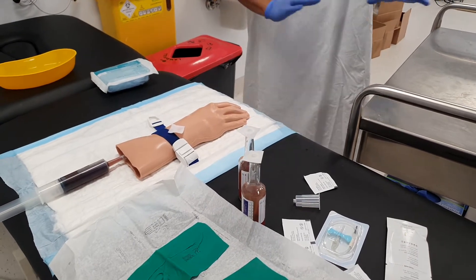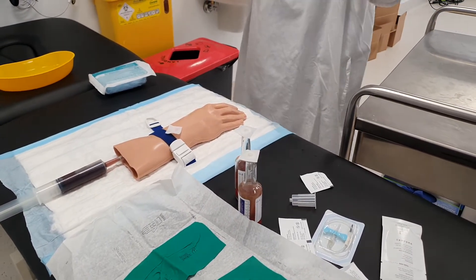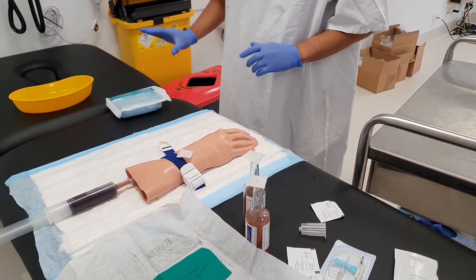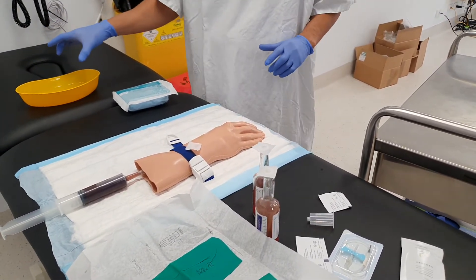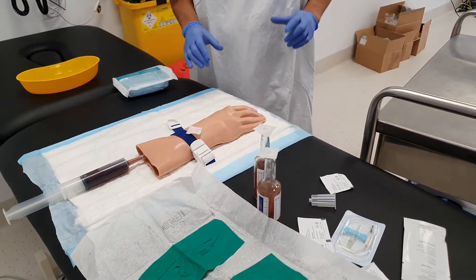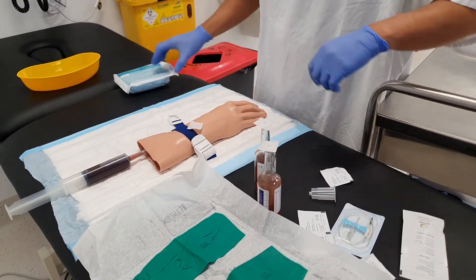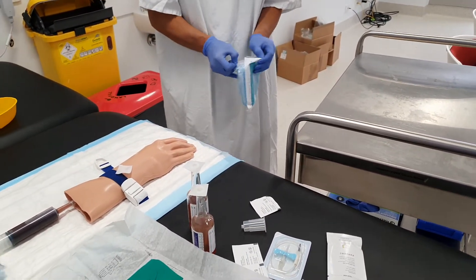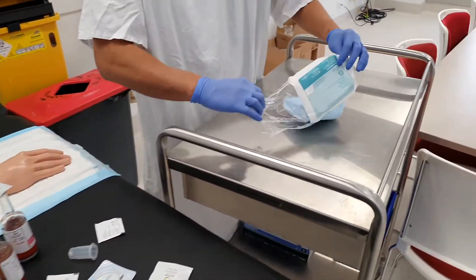I've set things up so that my area is going to be here, patient's here, I've got my sharps container, I've got my dirty general waste, and I've got my injection tray for my sharps. I'll just open up my dressing pack now.